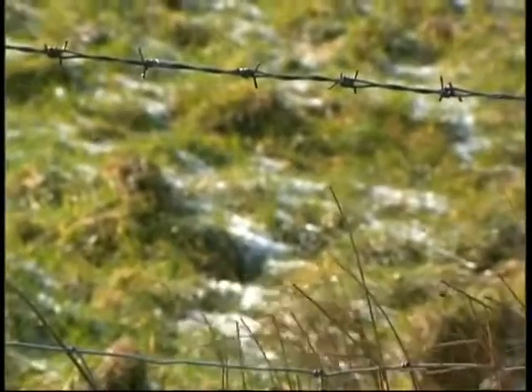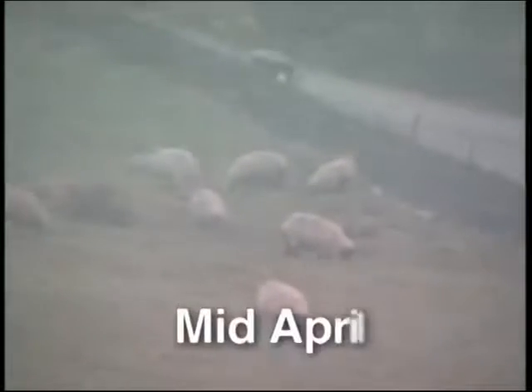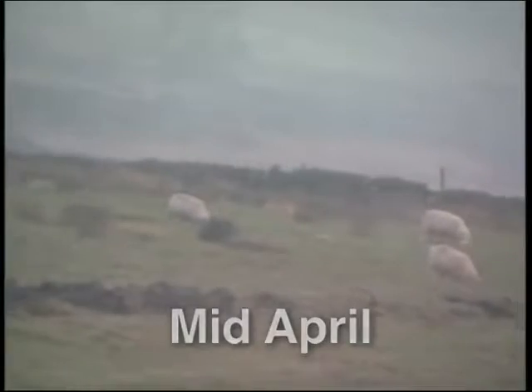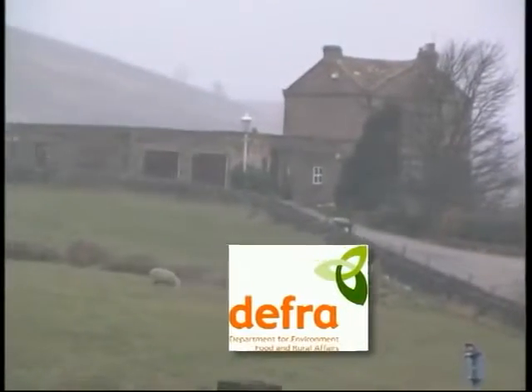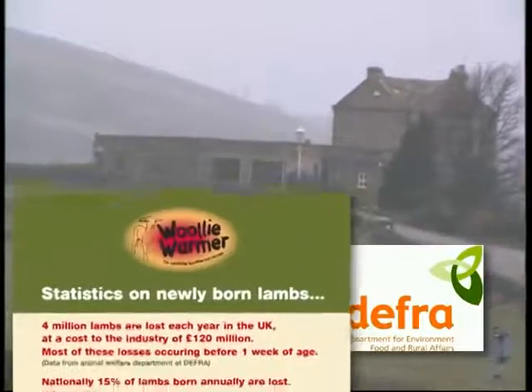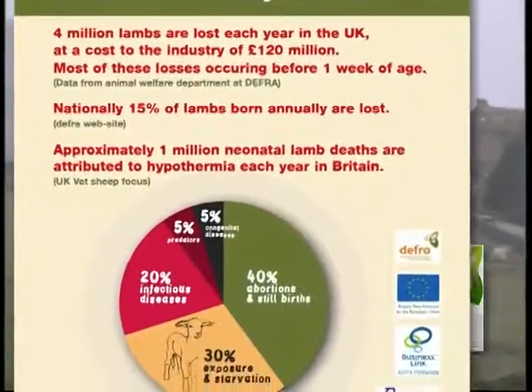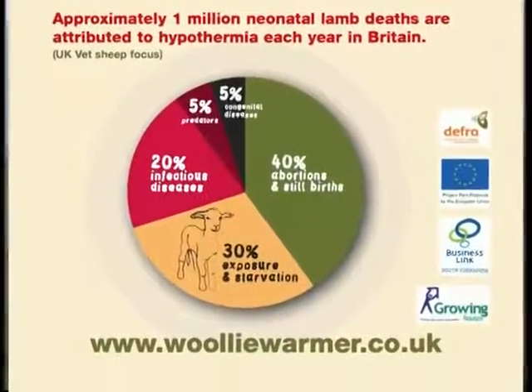In our ever-changing climate, it's not unusual for us to experience extremities of cold periods during the lambing season. DEFRA have reported that over 30% of lamb deaths are directly attributed to hypothermia, at a cost of around £30 per lamb, making this a major concern for the sheep farming community.